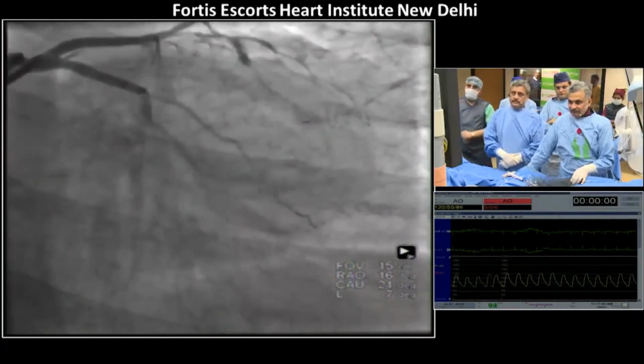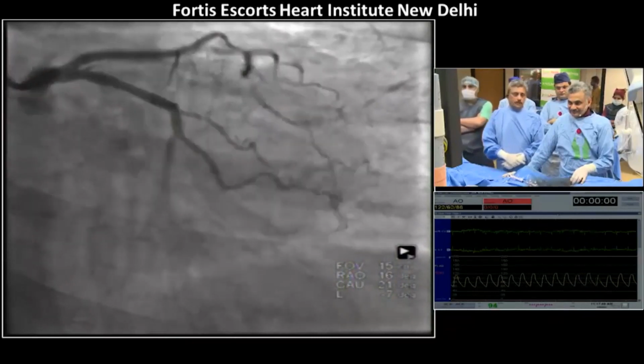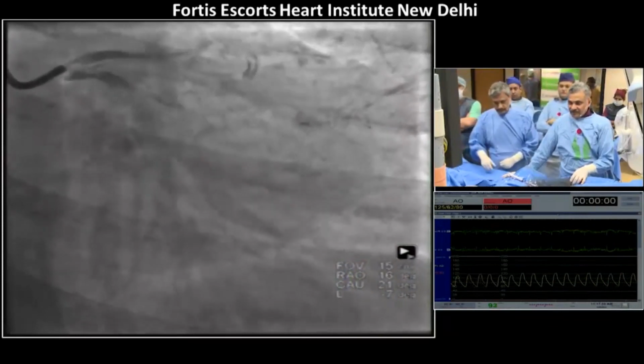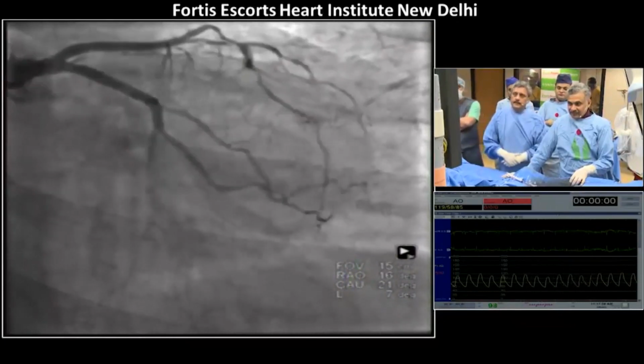Was there a troponin leak here? Did she have a troponin that was positive? Troponin is positive. You can leave it alone, but she's pain-free at this point. But there's a good collateral in our lab. Yeah, I think I will leave it alone, and it's significantly positive.